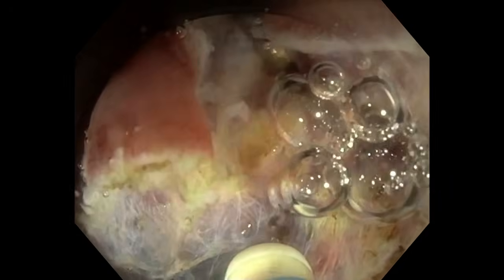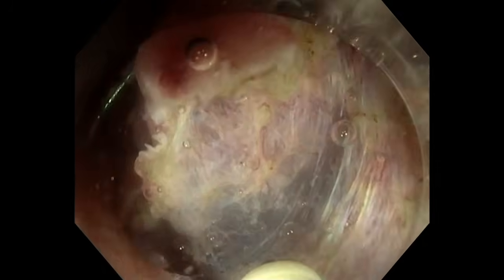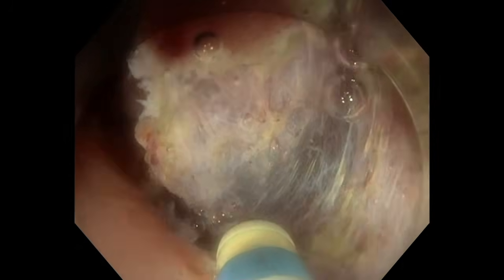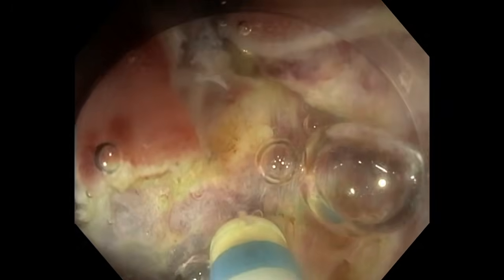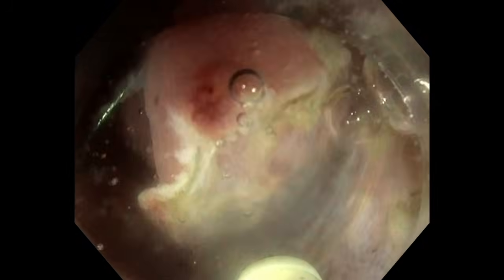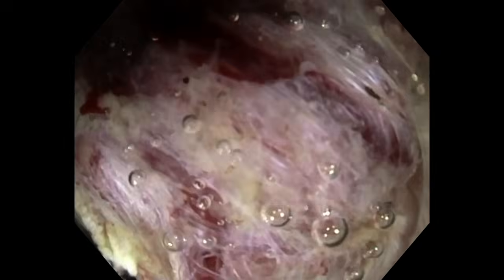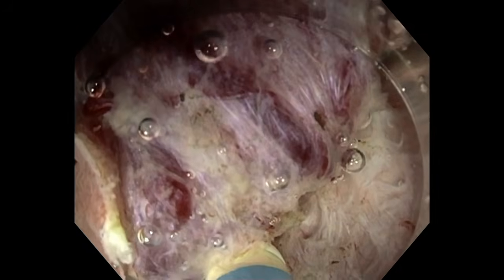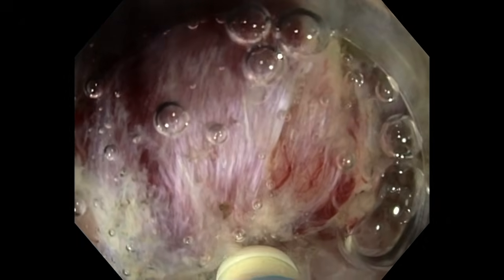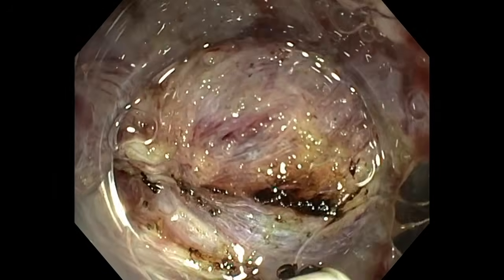After this, I will go under, and I always help myself with underwater strategy to open the space, but we can see that traction helps to remove the field and to track the blue layer and see it better. So once again, I will try to have blue on the left, go to the muscle retracting sign, do it in the left part, in the right part, and then try to join the blue from the left and the right because it will help to find this virtual area at the middle.